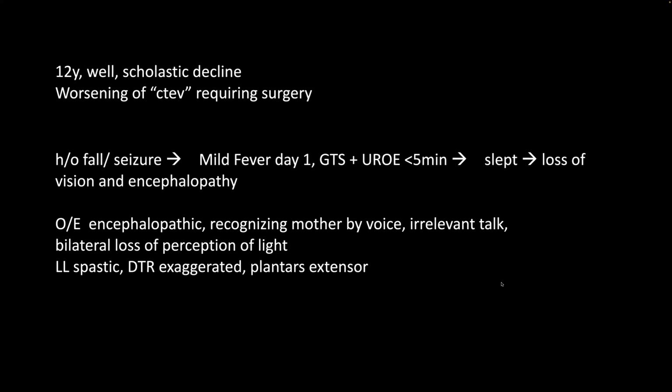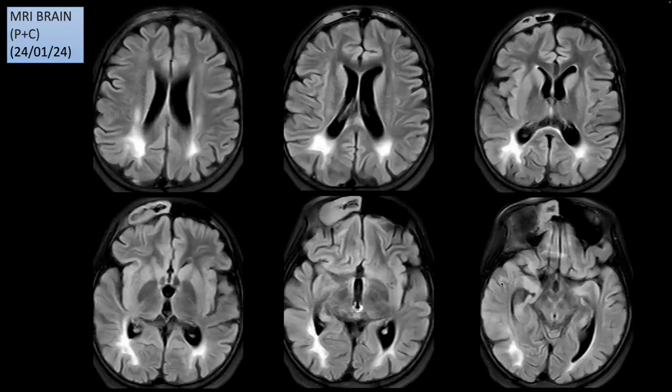All right. We'll see the follow-up MRI. Then we'll get back to the discussion. All right. Follow-up MRI. Again, you can appreciate the white matter changes. Possibly it's mild progression anteriorly, but you can appreciate again the mid and posterior white matter is stable. Demonstrating these hyperintense changes. Again, there is some degree of volume loss in the supratentorial brain parenchyma.